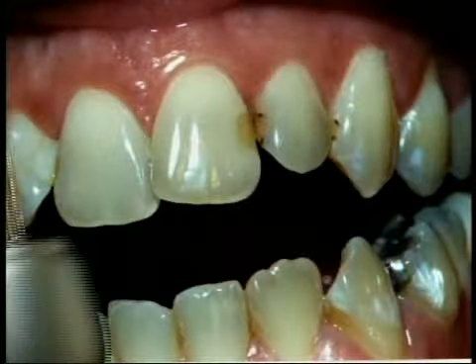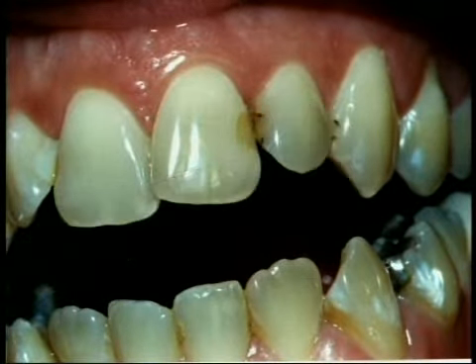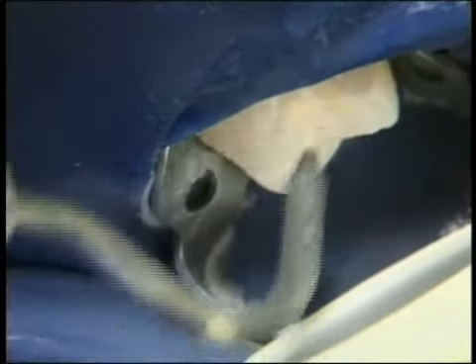Until recently, there was only one way to remove decay in teeth: with the traditional dental drill. Today, we're fortunate to have a new option that in many cases allows us to work without physically touching the tooth. This new technology is called air abrasion.